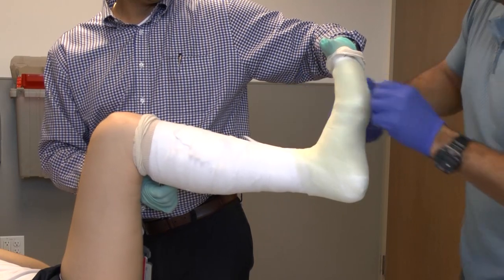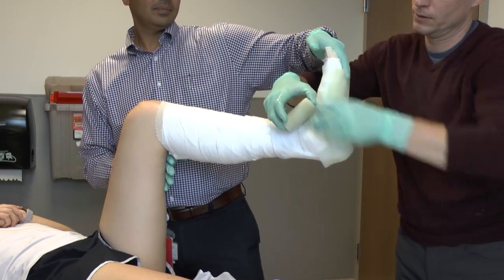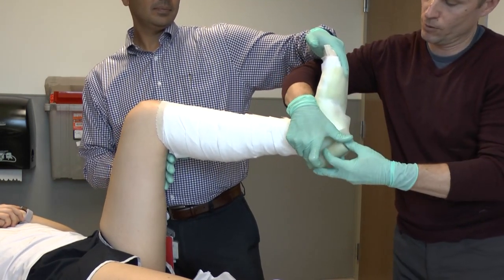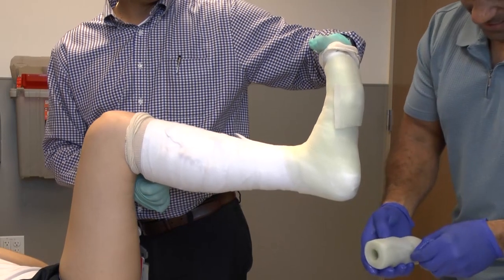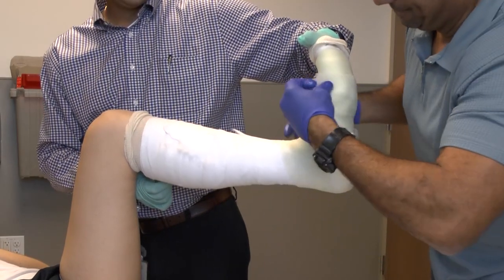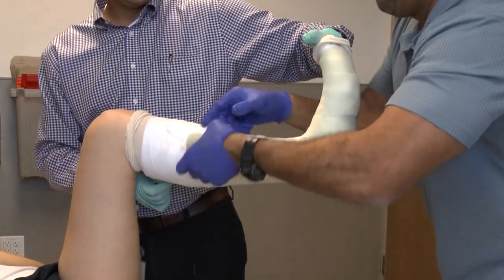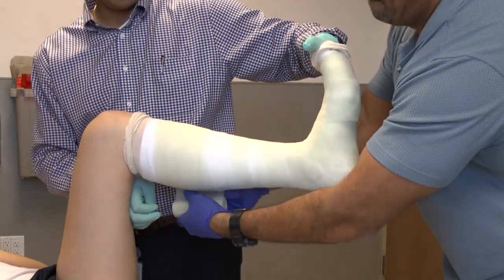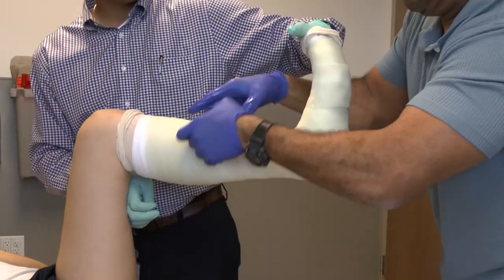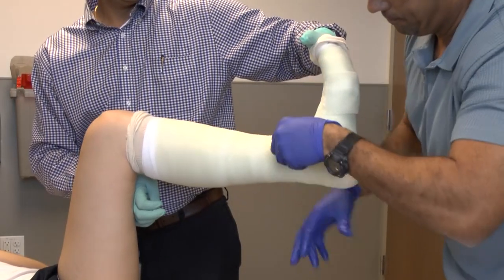You then apply the fiberglass around the ankle on the first pass, almost like a small stockinette. It is important to feather back and forth over the heel to minimize the amount of fiberglass placed anteriorly. Once you have applied this initial sock amount, address the tibia with further placement upward, remaining oblique proximally — longer anteriorly and shorter posteriorly — to allow the leg to bend nicely at the knee.